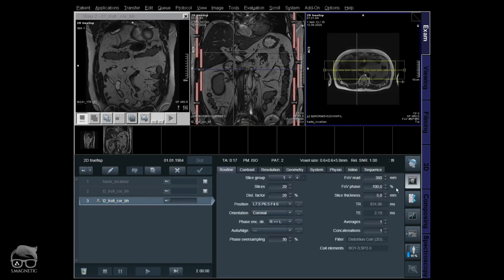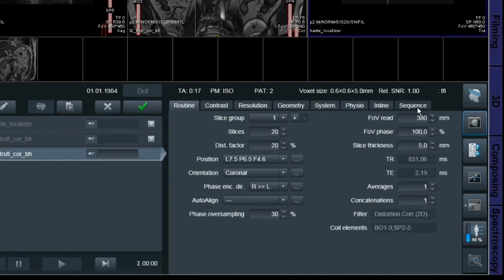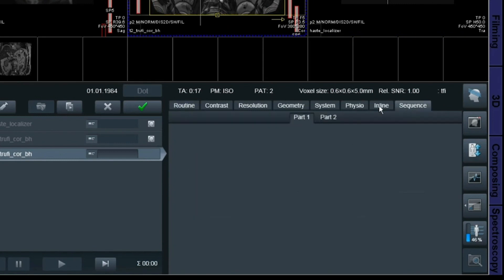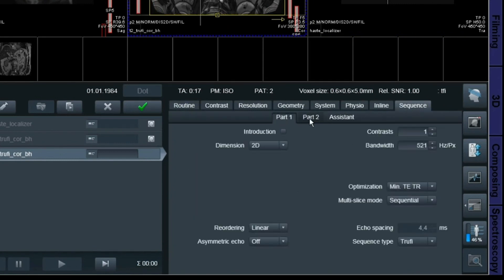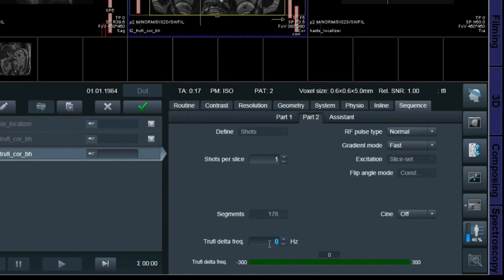We go to sequence card part 2, and down there you have something called TrueFi delta frequency. What you do here is you're not removing the artifact — you just shift it away from your area of interest. There's a large range here, minus 300 to 300. Let's try minus 50.